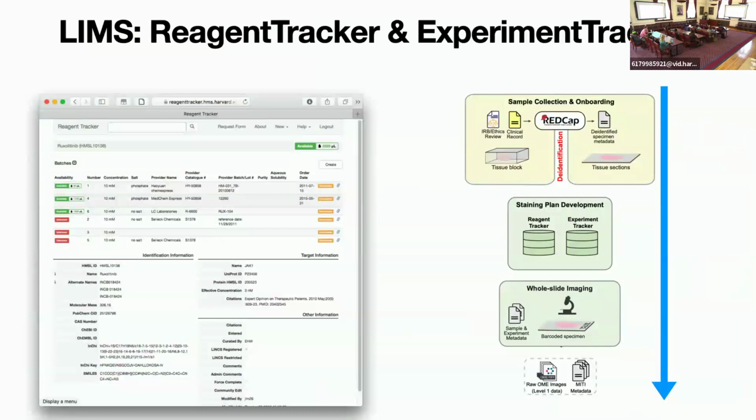So I mentioned before the work that goes into designing antibody panels and managing them. I didn't mention clinical data, but the other thing is clinical cohorts. We're receiving slides from collaborators at the hospitals. They're busy, they've got a lot to do, and they can't manage this stuff for us. So we get a box of 10 or 20 or 100 slides. We've got to figure out what's what and keep it distinct from all the other projects, and figure out what disease and what patient demographics are associated with the slides, so that when we analyze the data, we know, okay, these were the smokers and the non-smokers, or the progressors and non-progressors, or whatever the metric is that we're analyzing.